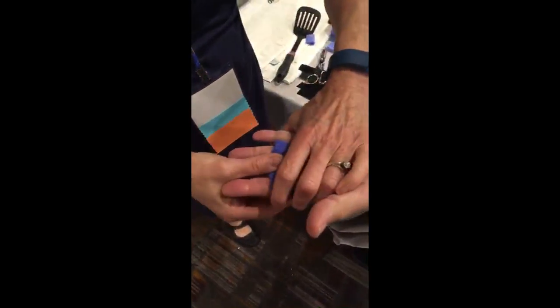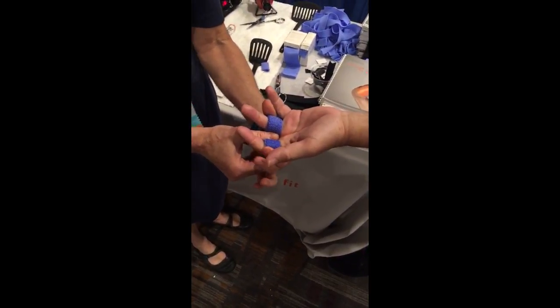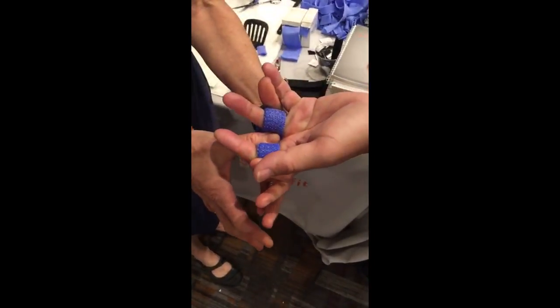Will it stick to itself? It sticks to itself when it's warm. Just relax your hand, Mark. And we're just going to, in supination, so I'm letting gravity help me, I'm just pushing the middle finger into more extension, making sure not to separate the fingers.